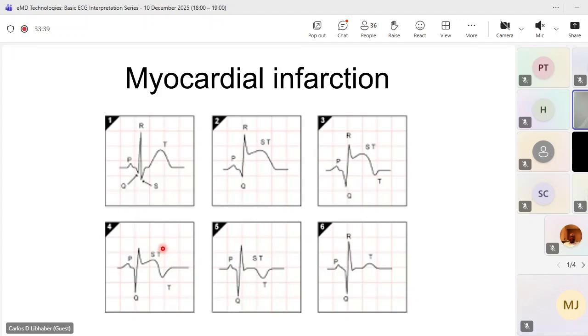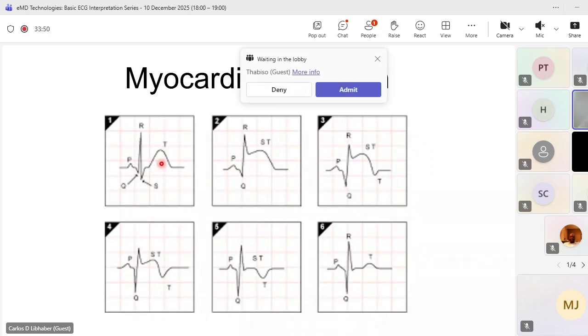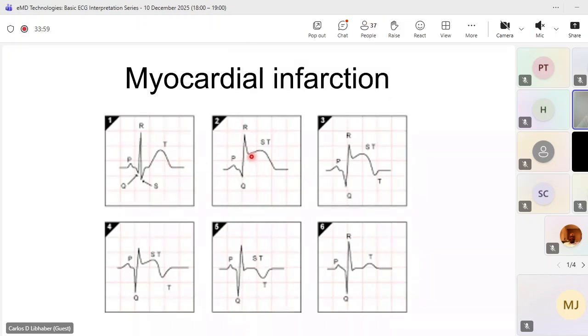Here you have again this patient who comes with a P, QRS, T, big T wave, big T wave. He's having pain. Now the ST is elevated. You can see it. I have a small q, but eventually the q, which represents necrosis, is wider and deeper.